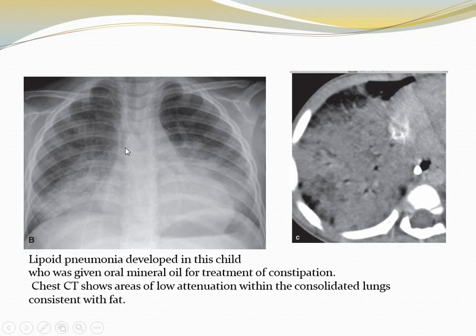This is another case of bilateral patchy opacities in the lung bases. CT scan shows low-attenuation areas inside, indicating fat-containing consolidation, consistent with lipoid pneumonia developed in a child who was given oral mineral oil for treatment of constipation.